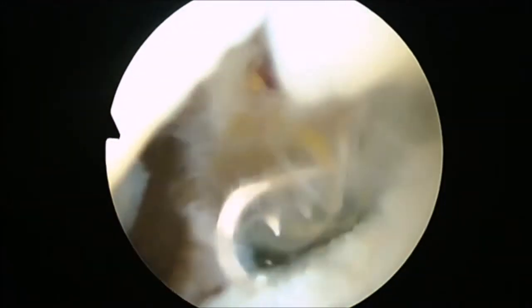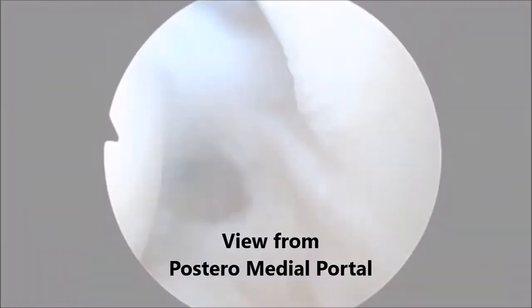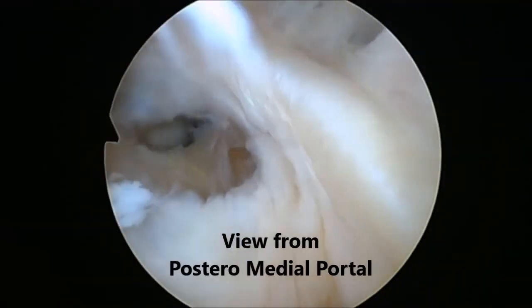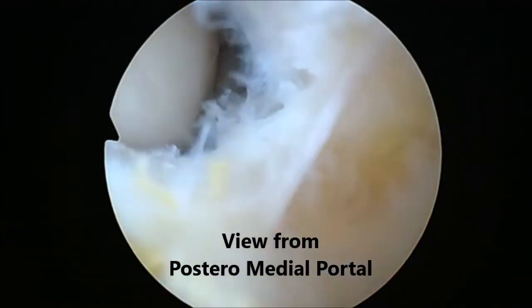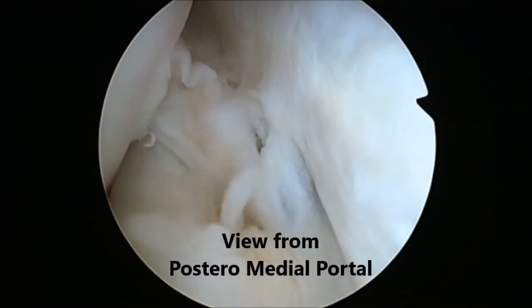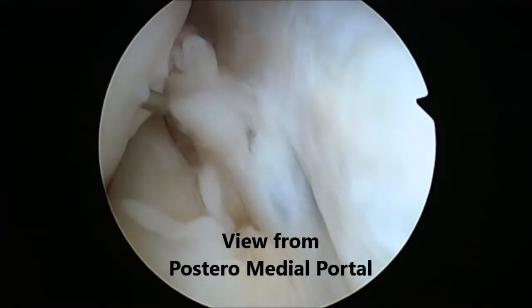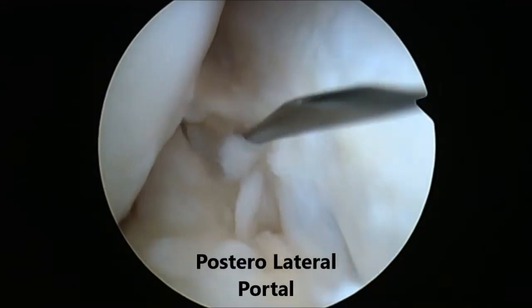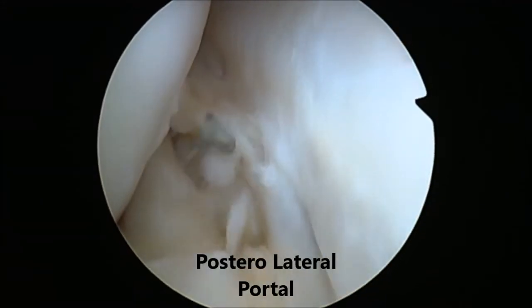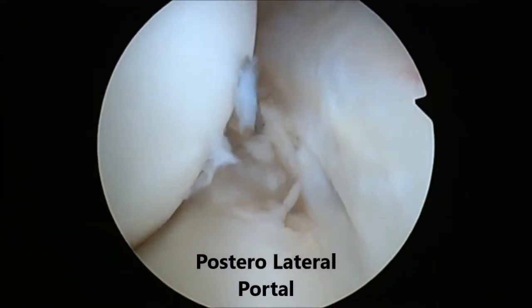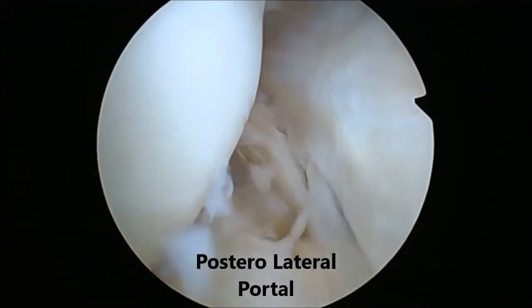Now, the camera is introduced in the posteromedial portal, passing through the hole in the septum previously created by the shaver. Also, using transillumination, a needle is introduced in the posterolateral aspect of the knee, followed by a number 11 blade scalpel, creating the posterolateral portal.